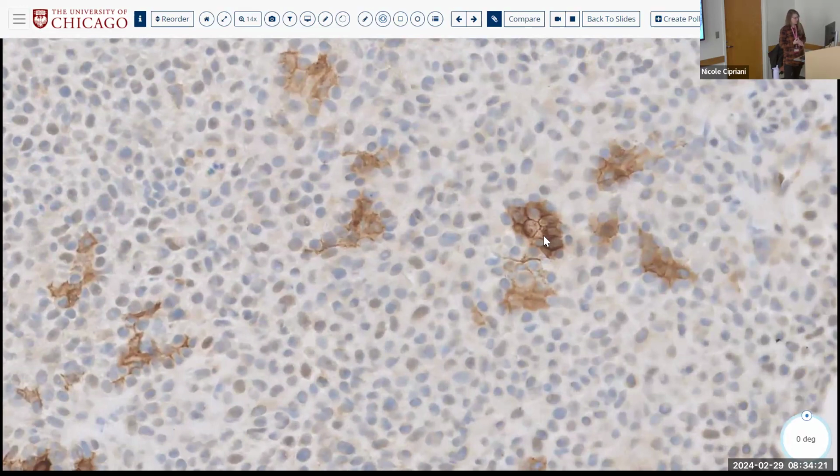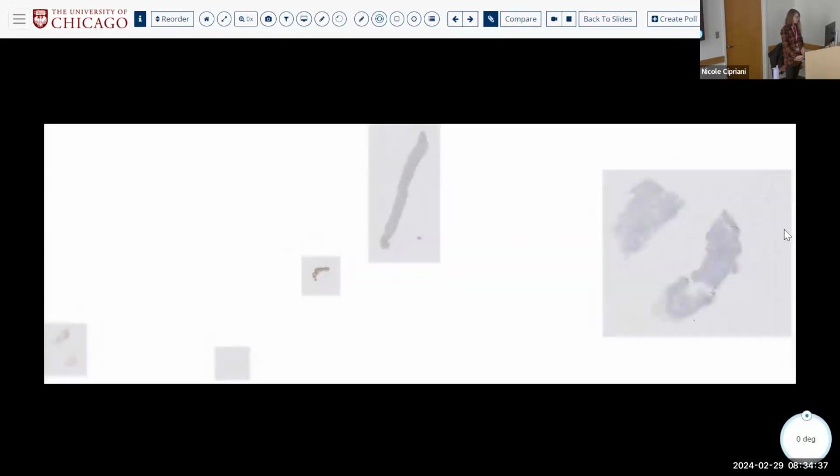So we now have a biphasic thing. So it could be epimyo-ep, and it still could be a cellular pleomorphic adenoma, right? Because we don't have the edge. We don't know if it's invasive or not, but we do know that it's biphasic, and we do know that it's low grade. So low grade biphasic salivary neoplasm.